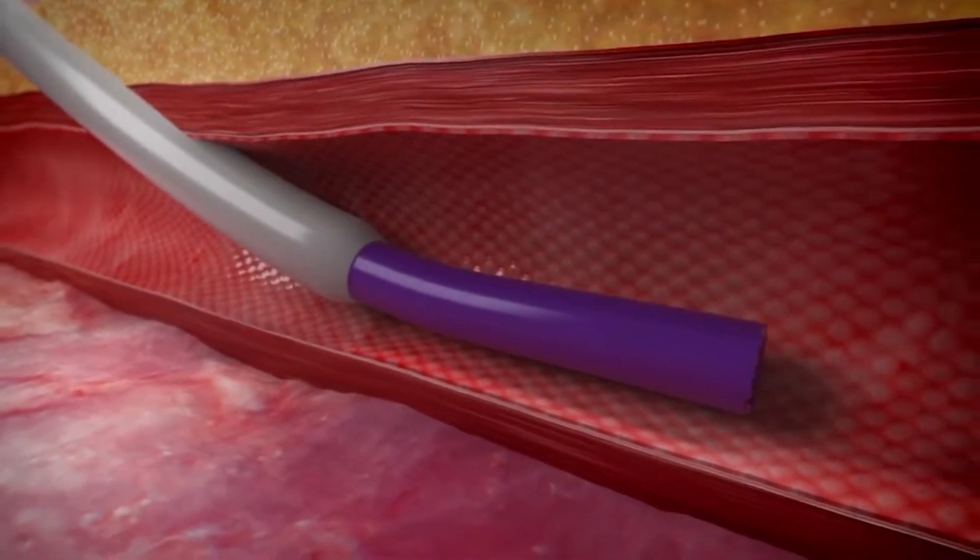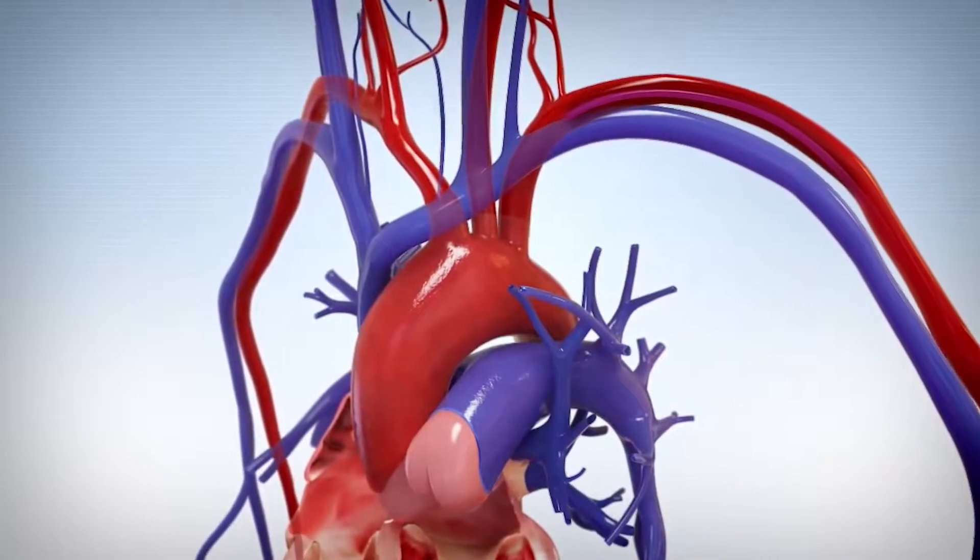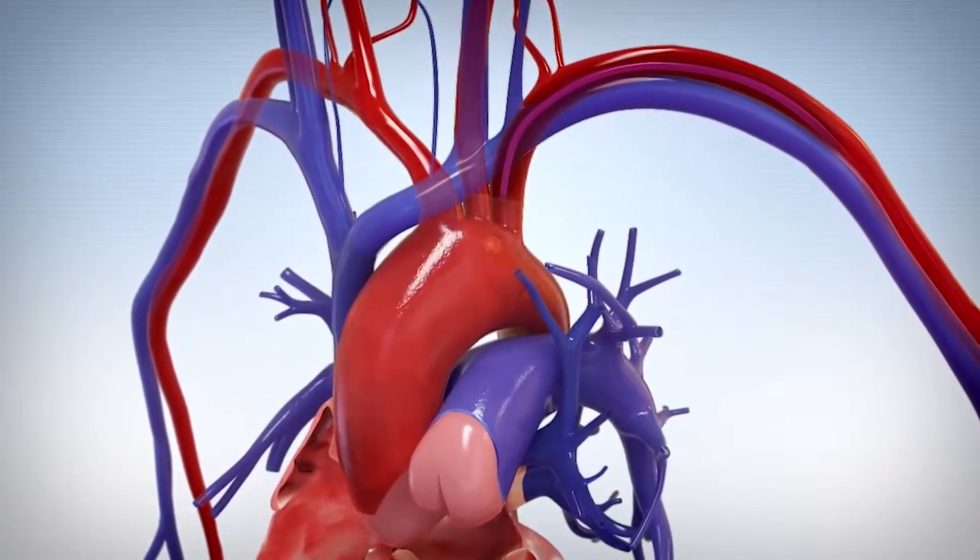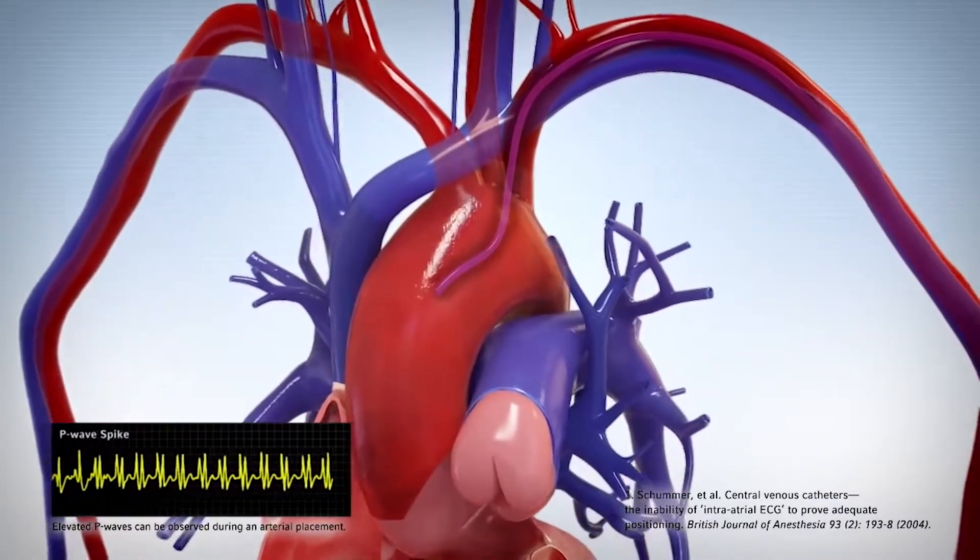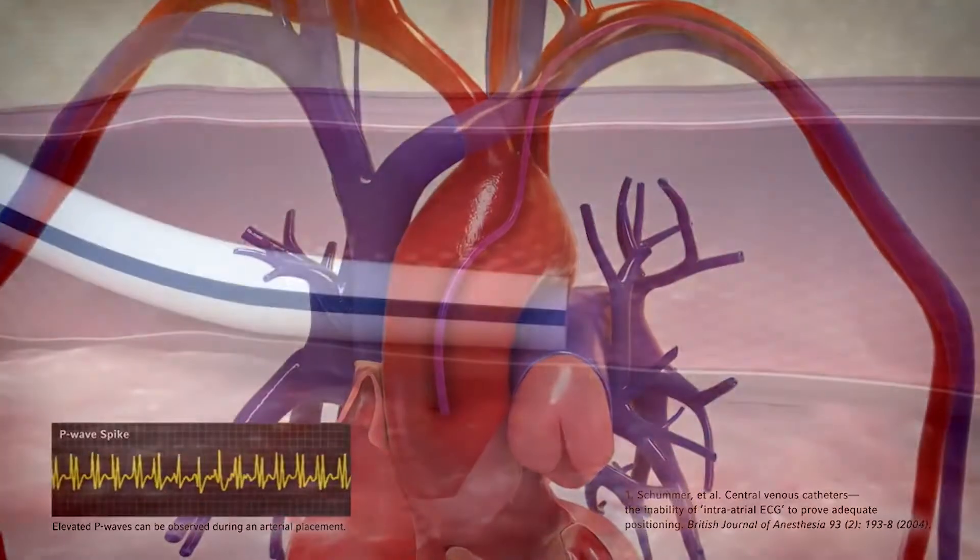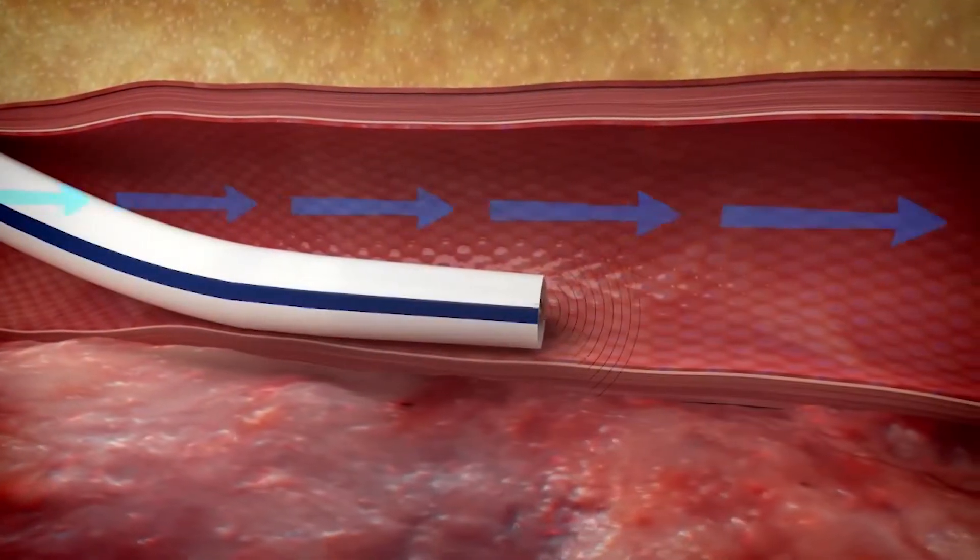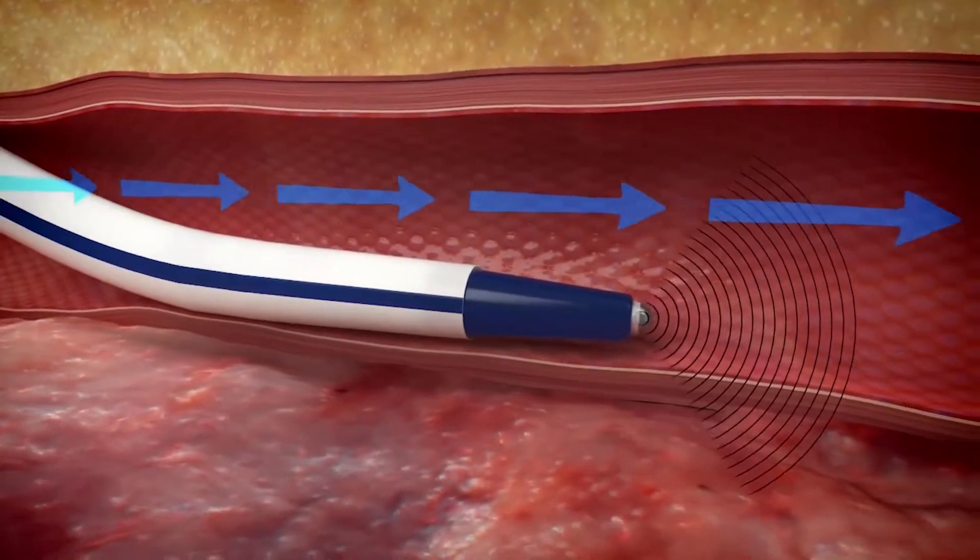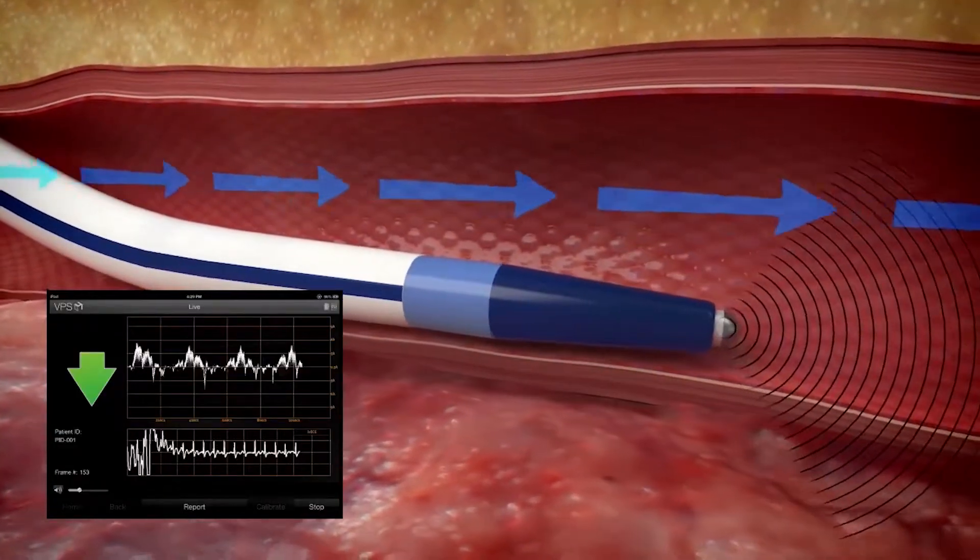In the unlikely event a catheter is placed into the aorta, it can cause serious complications including mortality. Unlike ECG only systems, as the Arrow VPS stylet enters the vessel, it immediately begins to monitor blood flow direction.